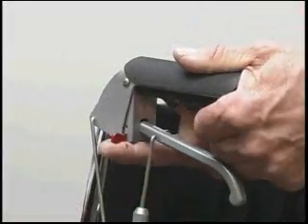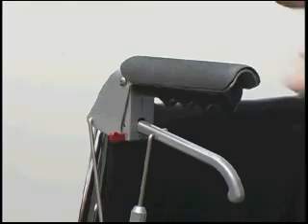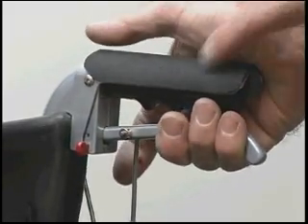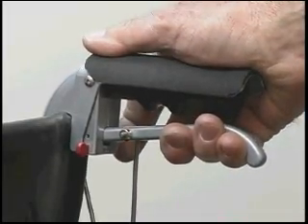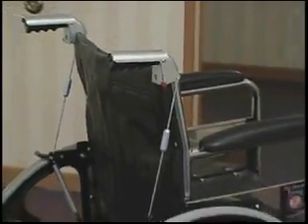The attendant brake can be locked off to the outside or the inside. When locked off to the outside, depressing the palm release lever will release the lock off and apply the brakes. However, when locked off to the inside, the lock-off does not release when depressing the palm release lever and must be manually released. This allows use of the incline brake and the attendant brake lock-off system at the same time. It is important to note that the wheelchair should never be left unattended with the red lock-off levers engaged.